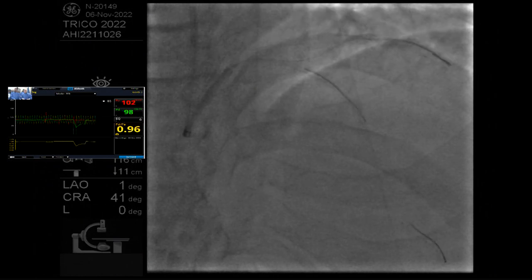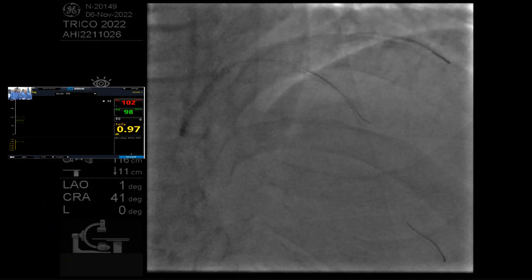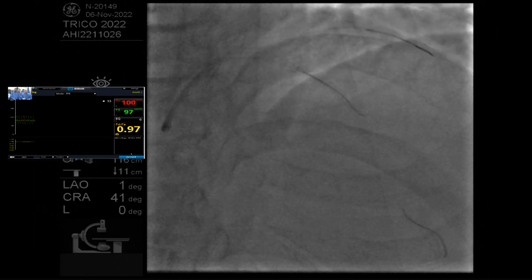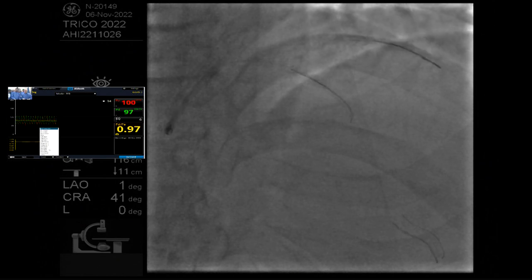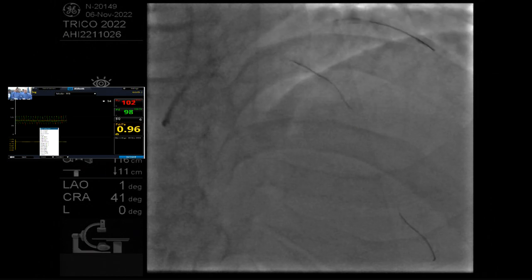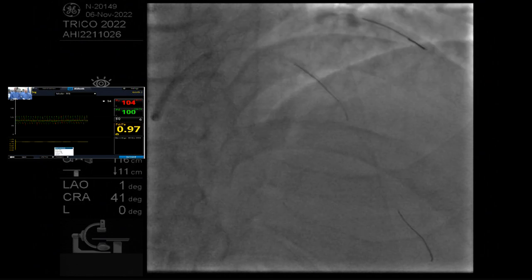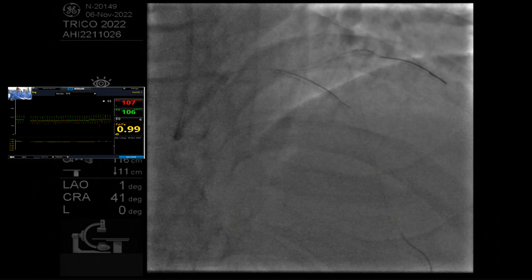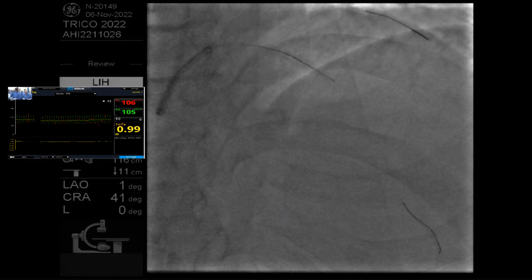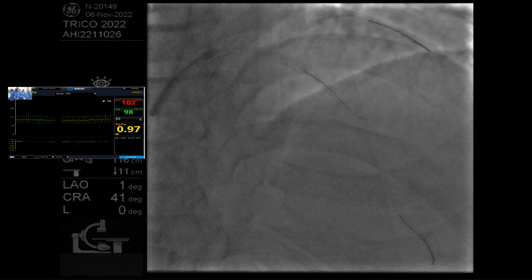Right. Yeah, I think your point's well taken, in that you may be normalizing within a stenosis, which is why my approach is that, we know the angiogram doesn't look at the left main very well, so I normalize all of these in the aorta. Practically, you just bring the FFR wire to the tip of your catheter, push on the wire that you already have inside, bring your catheter outside, then you equalize when your catheter is out, so you don't have to bring the FFR wire outside in the aorta. Sure, the transducer is outside the ostium, that's all. Yeah, the tip of the guiding is outside the ostium. Okay.